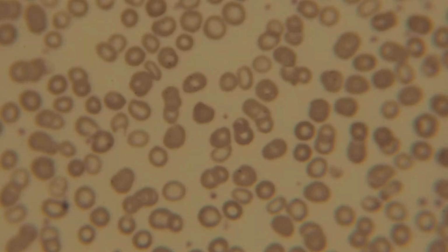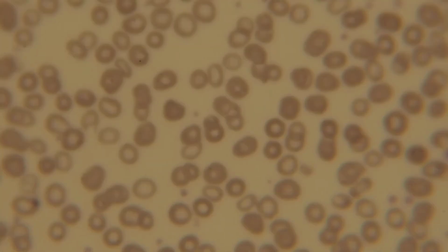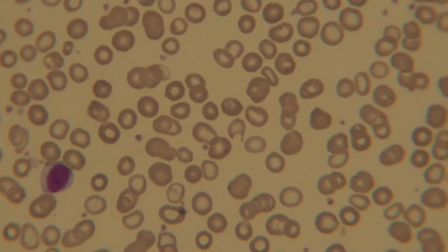I chose this slide to show you not only anemia, but also that formation that I told you guys about. When the erythrocytes stack themselves like a stack of coins, that phenomenon is called rouleau. You can see right here in the middle of the screen, those erythrocytes are piled in a formation that we call rouleau.